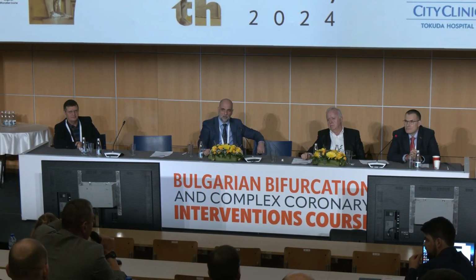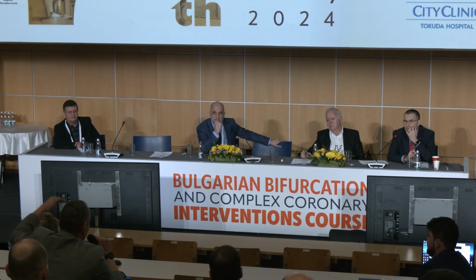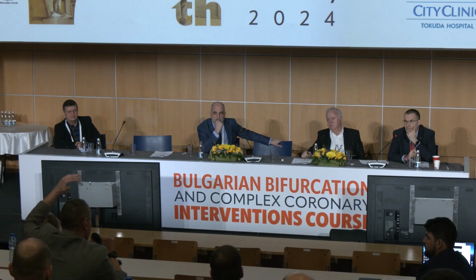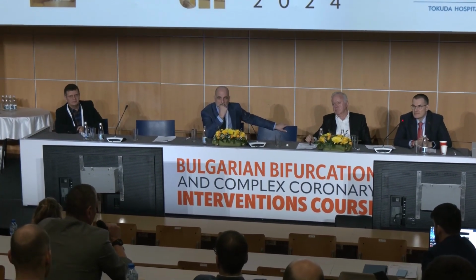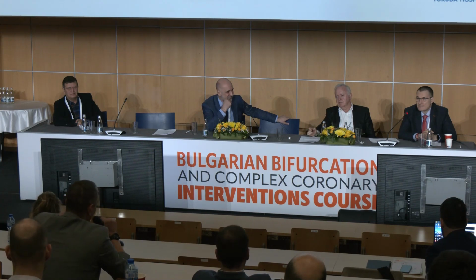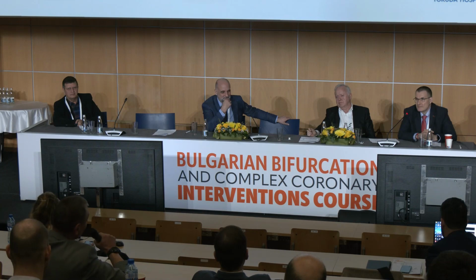And when we started implanting pacemakers the first time in 2006, we were working on a plain X-ray, which had a tube over our heads and a detector under us. And one time we actually took a real-time detector from nuclear medicine, something like a Geiger-Müller counter. When you put the pedal to the metal, it starts screaming immediately. Two days, we threw it out. So everybody knew then what's happening when you put the pedal to the metal.